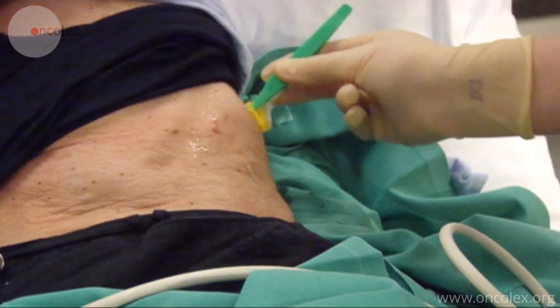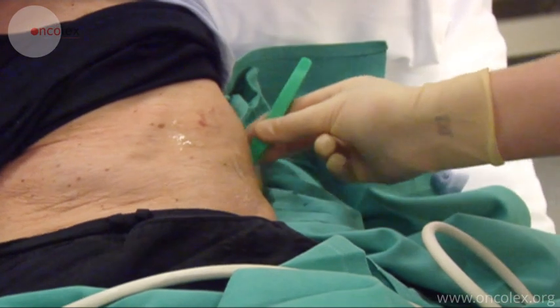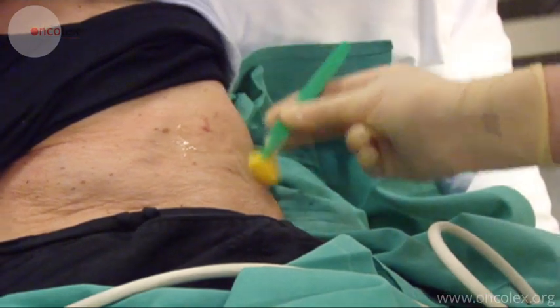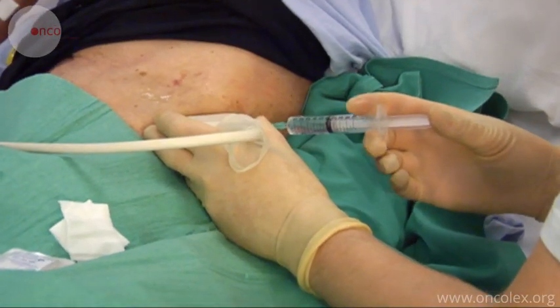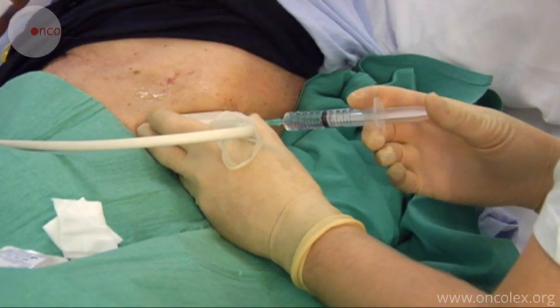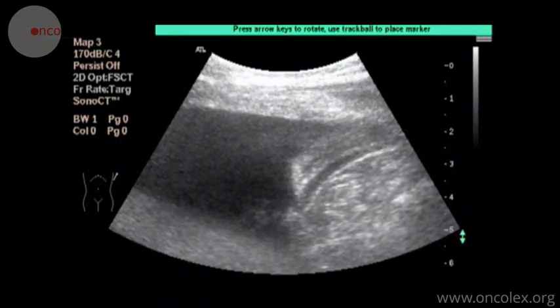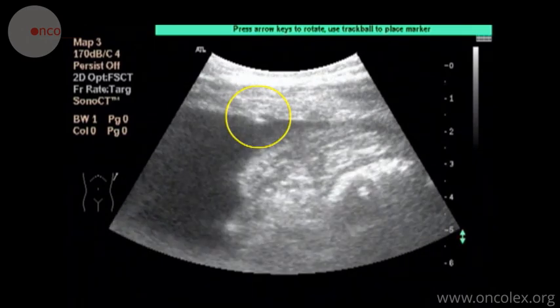The puncture site is disinfected. Local anesthesia is injected in all the tissue from the skin to the pleural space.